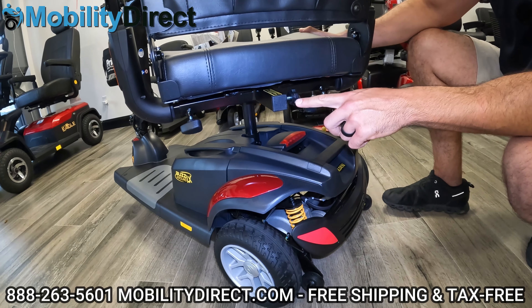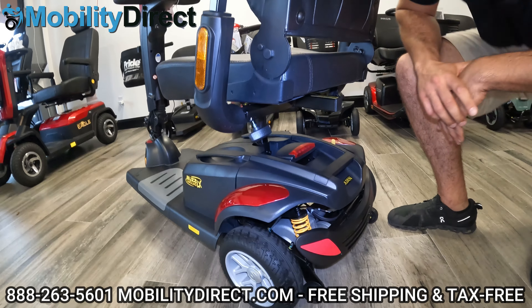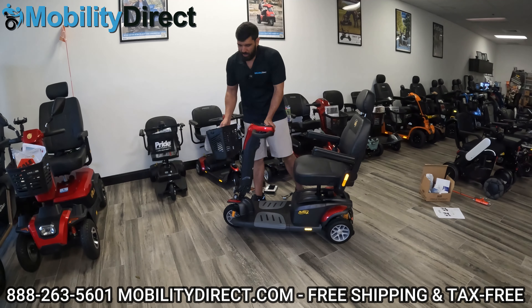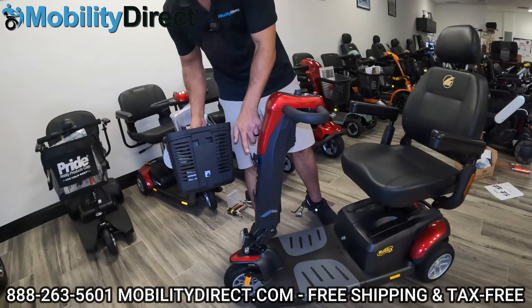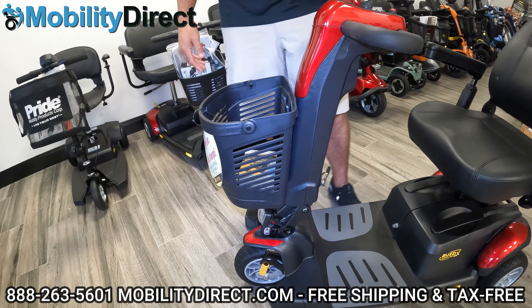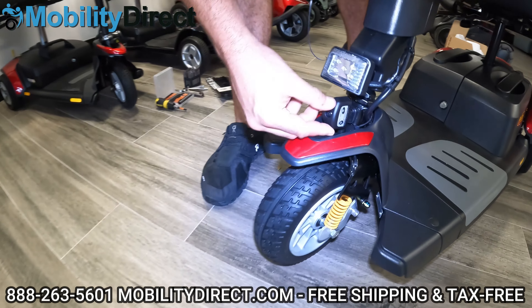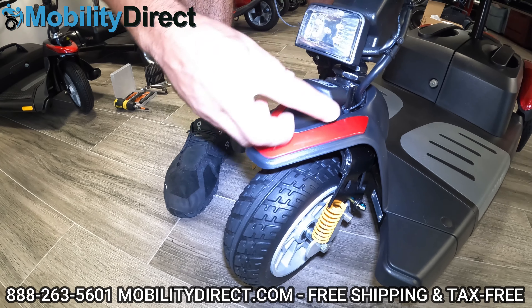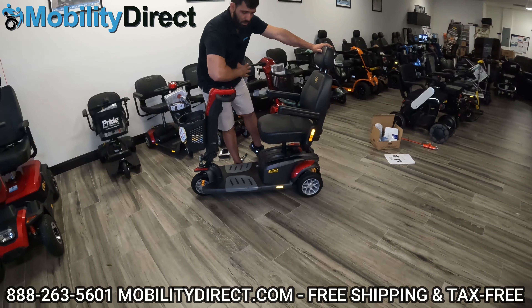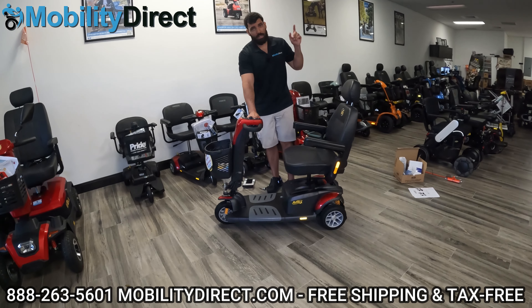On the back there's that universal hitch receiver, so you can put things like a shopping basket, oxygen tank holder, walker holder, or fishing beach cart. Our review video is going to take this to the grocery store and fishing — it's a great scooter for all that. As far as the basket, it attaches to the front — there are three hooks and three holes. Line up the holes with the hooks and push straight down — it just clicks into place. Out of the box, it's going to have the steering lock on. To unlock the steering, push the spring-loaded button and rotate counter-clockwise a quarter turn — now your steering lock is disengaged. The steering lock is there so the steering wheel doesn't go crazy while you're transporting the scooter in your vehicle.